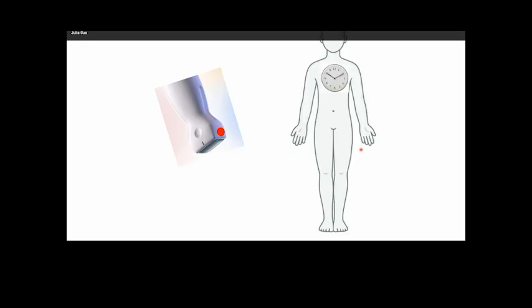All right, so here we have an ultrasound probe with the indicator. And here is a man with a clock. So I'm going to explain what this means. So remember that our heart sits in the left side of the chest, right? And our heart is one of those organs that's not exactly up to down or left to right. It actually sits tilted in the left chest, right? I want you to remember this when we're doing the cardiac ultrasound, okay?